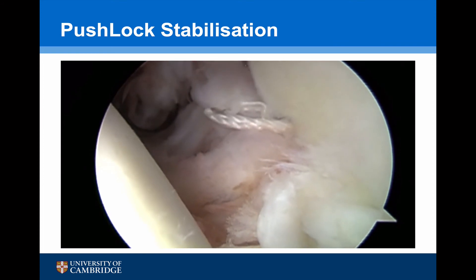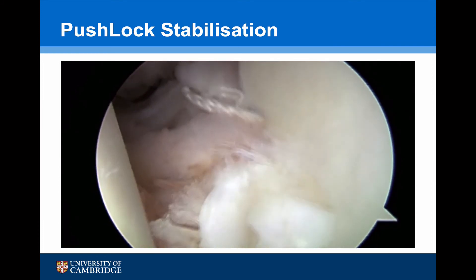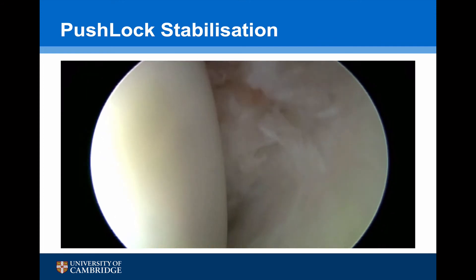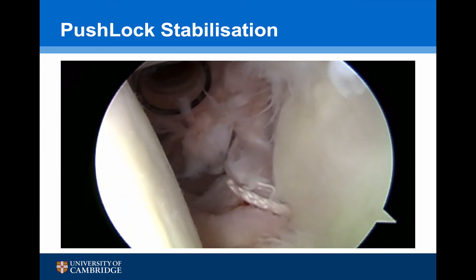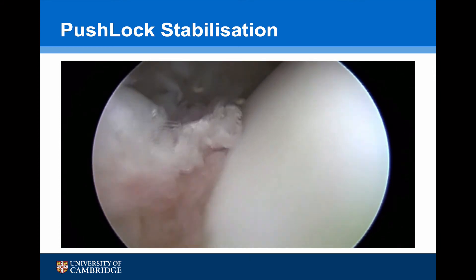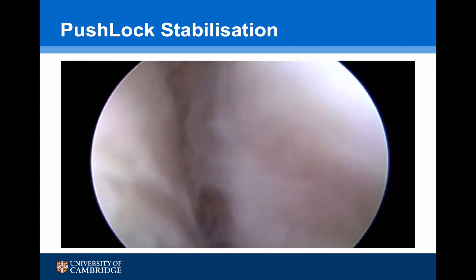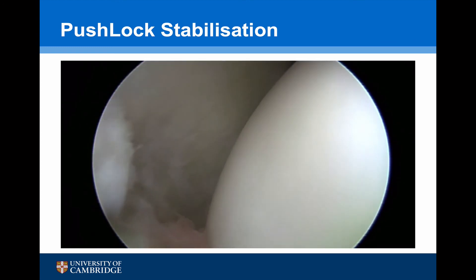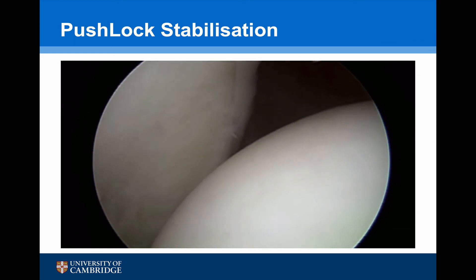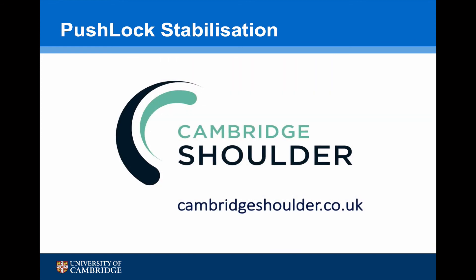At the end of the procedure, we can see that we've got nice suspension of the capsule and we've recreated the bumper of the labrum. Putting the scope in from the front, we can see that the capsule has been nicely brought up and re-established the anterior inferior glenohumeral ligament, with good internal and external rotation which isn't pulling on our repair.